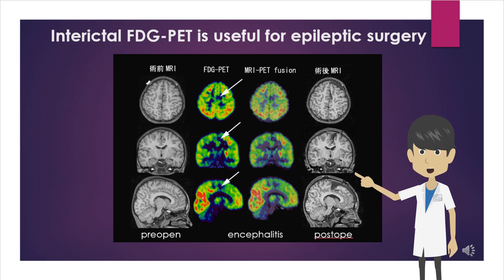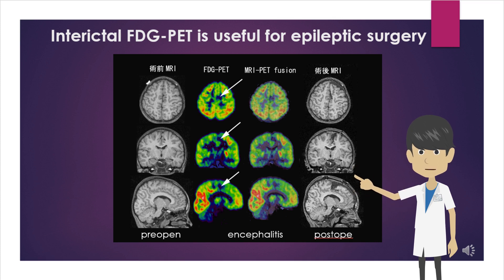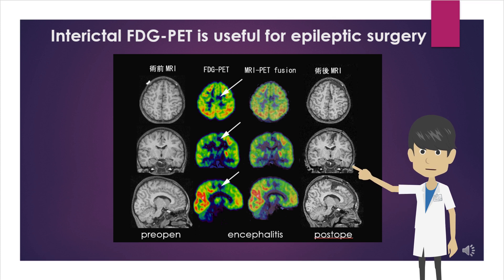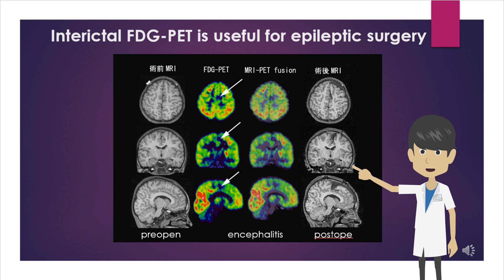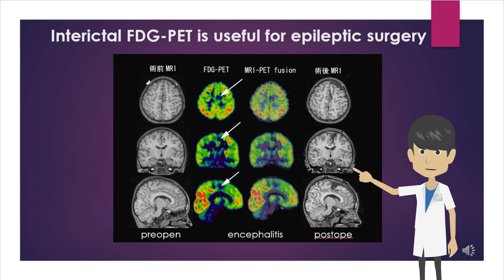PET of glucose metabolism in the interictal phase can provide useful information for epileptic focus resection. In this case, MRI shows a small cystic lesion in the left supplementary motor area, and glucose metabolism PET shows hypometabolism around the lesion, which is more evident on fused MRI and PET images. Epileptic seizures resolved after resection including the lesion. Post-operative pathology showed evidence of encephalitis.